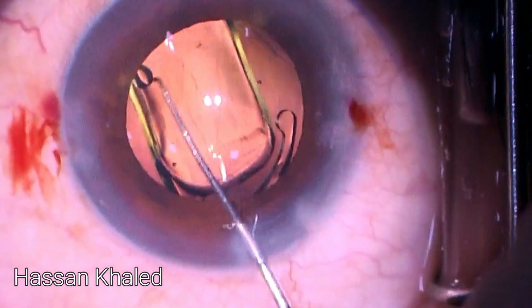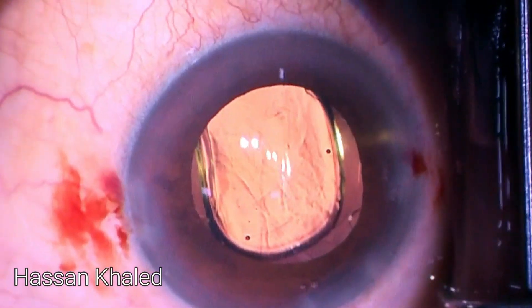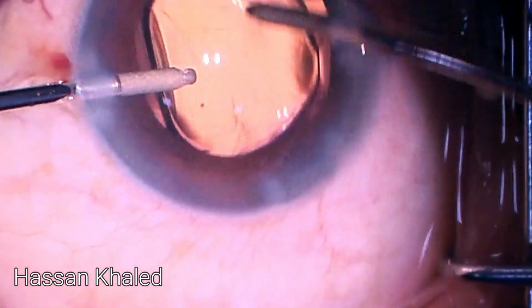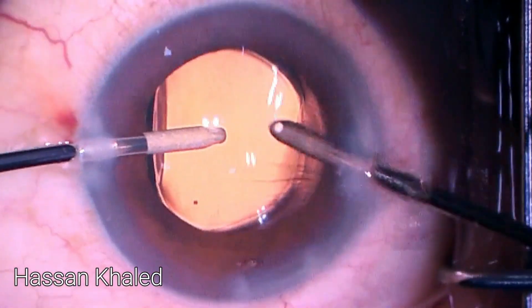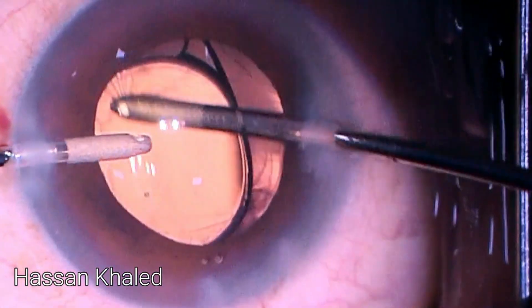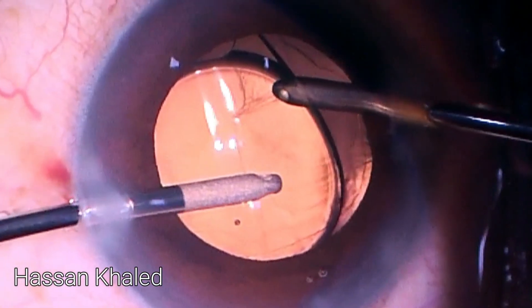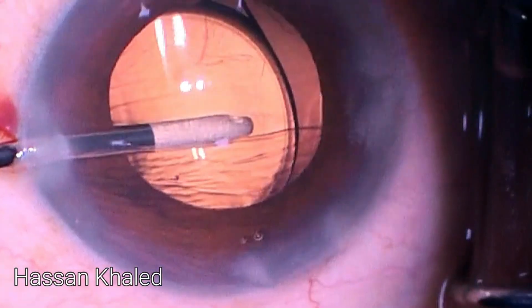After removing the viscoelastic anterior to the IOL, I went behind it, and when trying to remove the viscoelastic there, I hit the posterior capsule — and it was already open. The tear appeared small, so I kept irrigation inside the anterior chamber to prevent any collapse.